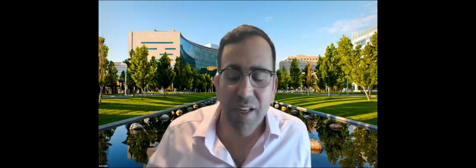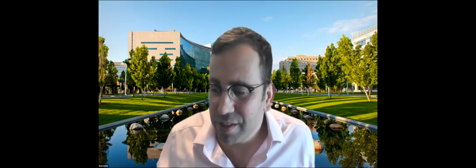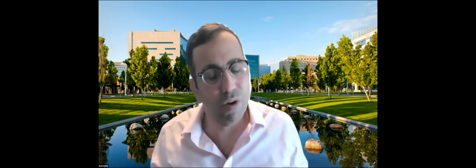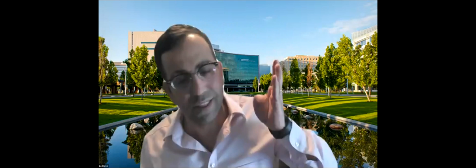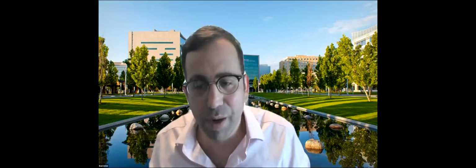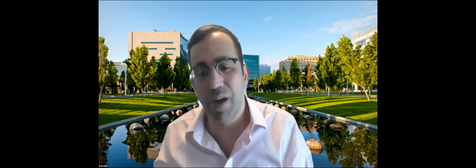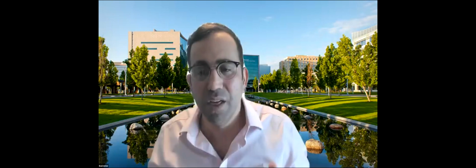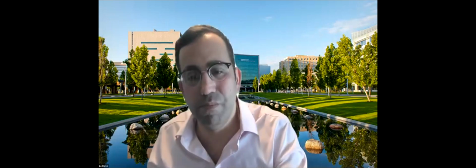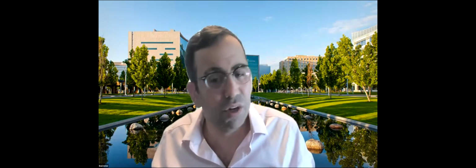Not only that, think about it: many times, dV to dt of the unipolar is not only determined by this small little surviving myocardium, because most times you're not just right on it. So it's going to be determined by the mass of tissue. A big mass of tissue can generate a steeper dV to dt, but overall it's very accurate, so you don't have to do much annotation.